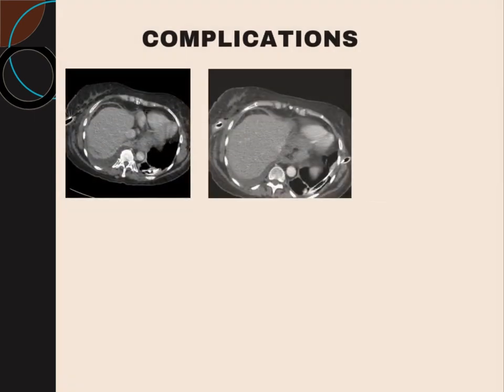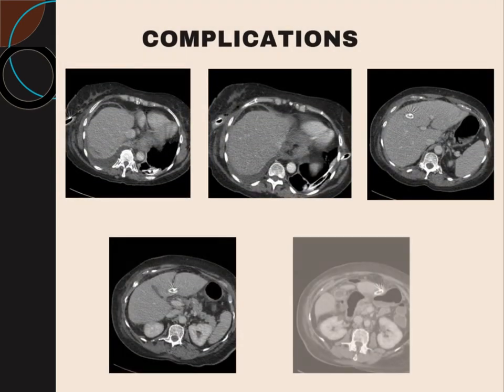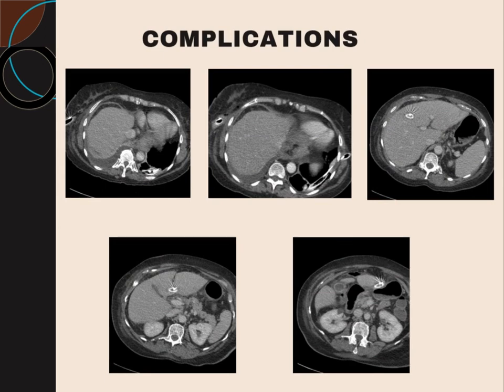Now, coming towards some actual genuine CT scans and some pictures we brought in for you guys to just be aware. When we say chest drain is a simple procedure, it will be a matter of about 15 minutes. But if you are not competent and are doing it out of hours, keep in mind it could lead to some worse complications, frankly speaking.